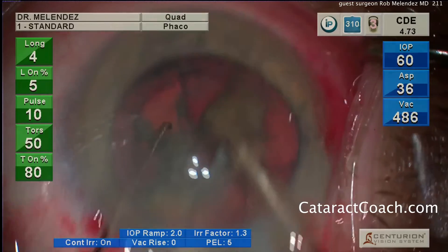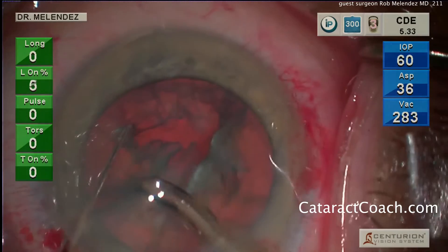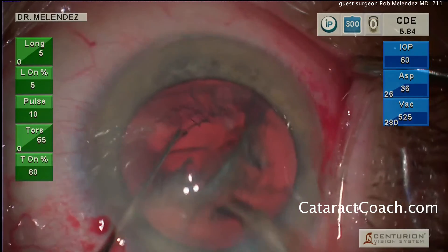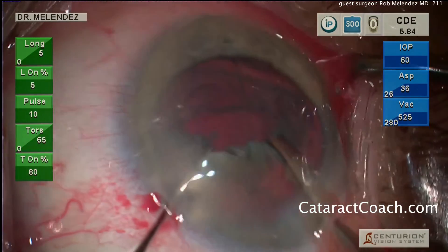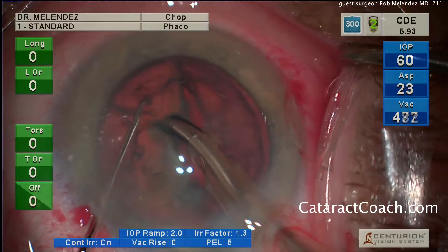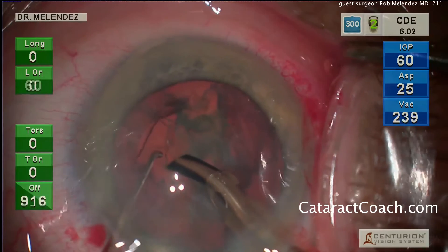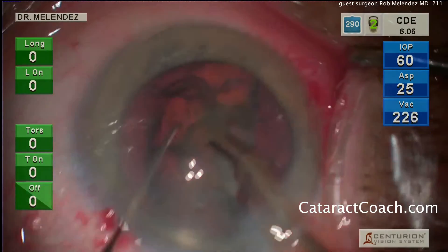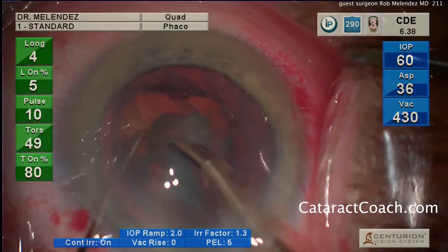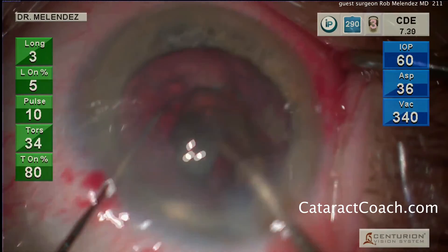These smaller pieces can then be emulsified. You can see this has a combination of torsional and longitudinal — about 10 pulses per second, primarily torsional with very little longitudinal. He buzzes into the piece, uses the chopper to chop it off, and each piece is emulsified. Notice he buzzes into the piece in position three — top right corner of the screen — emulsifies a little, then holds the piece for chopping in position two. And there goes the last of the pieces.